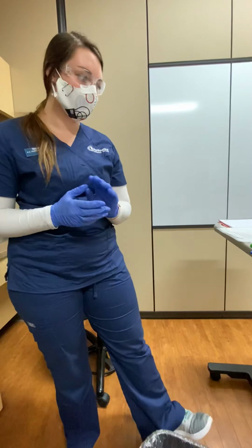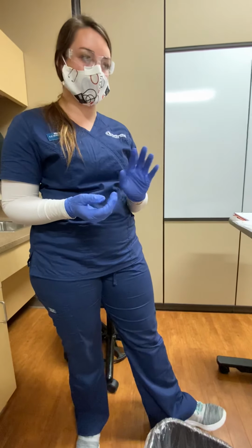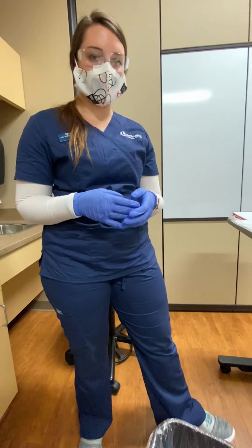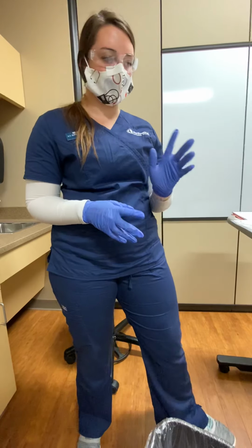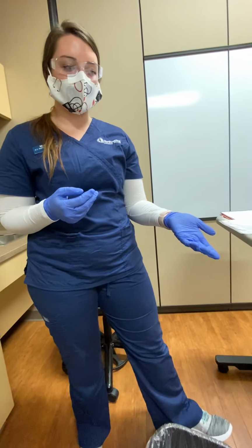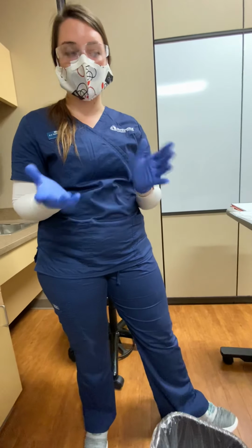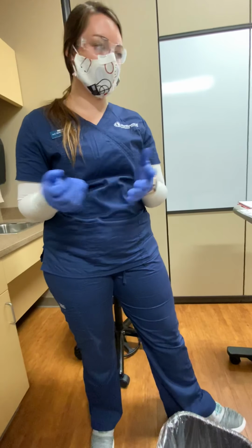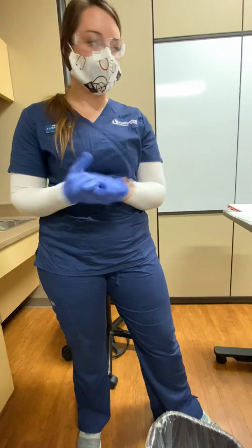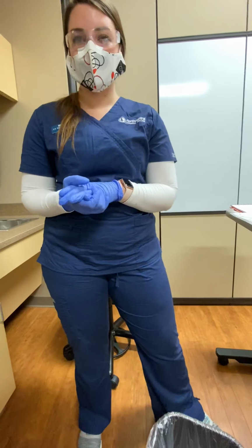One lifespan consideration would be if I had a pediatric or infant patient, I wouldn't use as much normal saline, or I would follow whatever is protocol for the hospital or facility, due to the shorter length of the tubing.